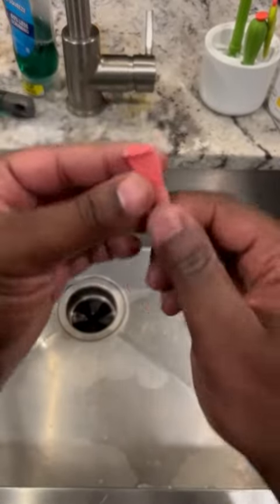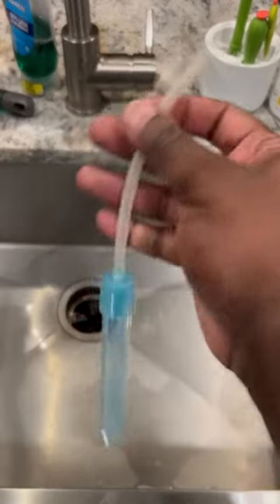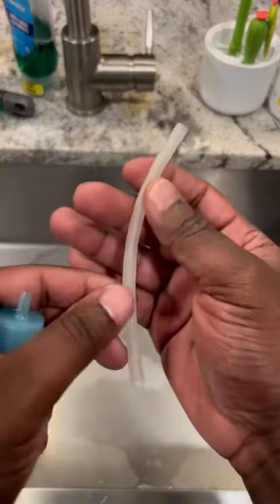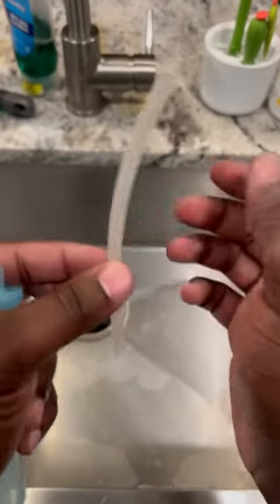First, looking at the top, this is a tip that comes right off and you can clean this separately. Then when you get your tube — it will be a really long tube — you can cut it to the length that you want, and then you keep the leftover so you can replace this if it gets bent up, dirty, or whatever.